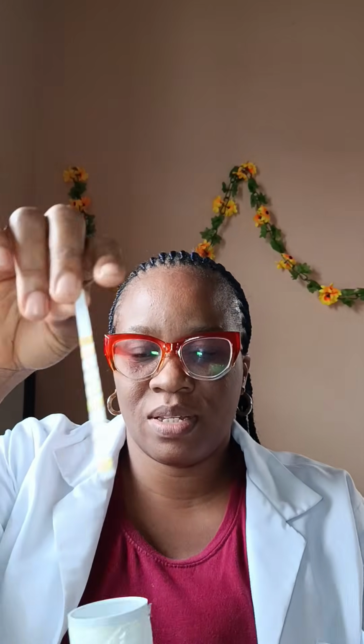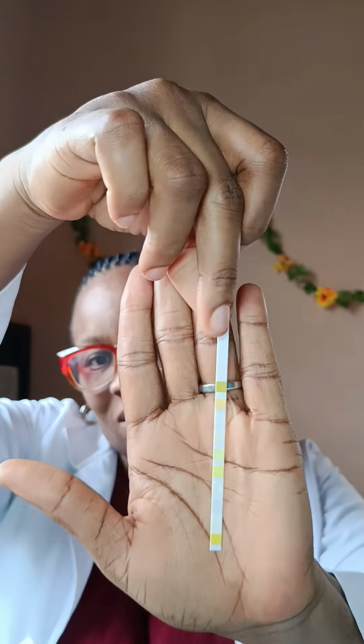Okay, let's talk about the dipstick urinalysis test. So this is the dipstick. Let me show you, this is what it looks like. I don't know if you can see it. And this is what the container looks like. The aim is to examine the physical and chemical characteristics or properties of urine. For the apparatus, we have the dipstick. You should be able to identify it when we place it on the table and say identify specimen A.